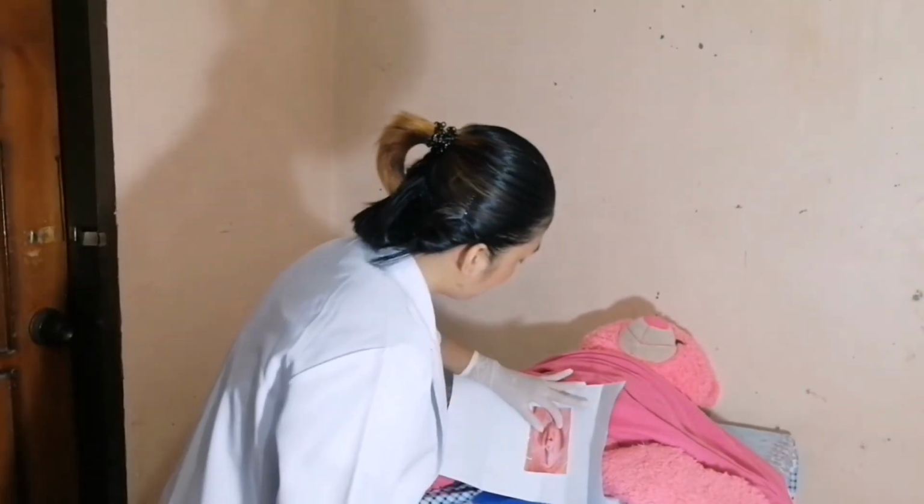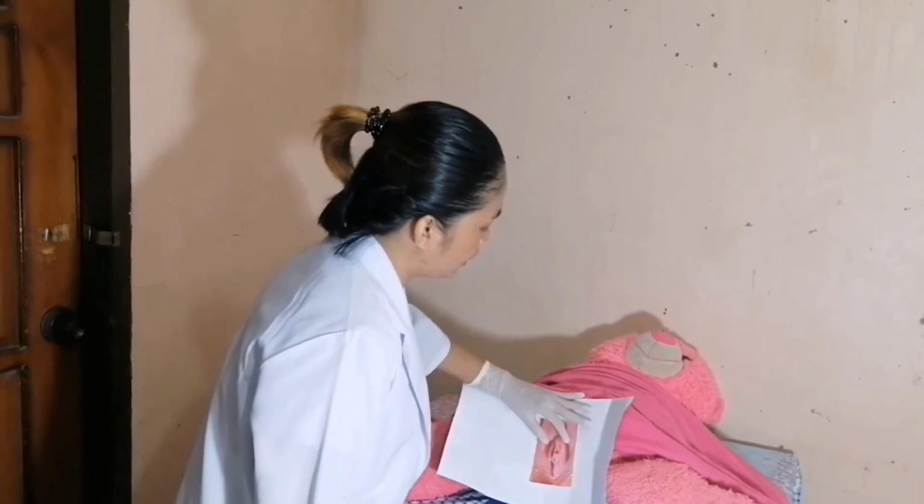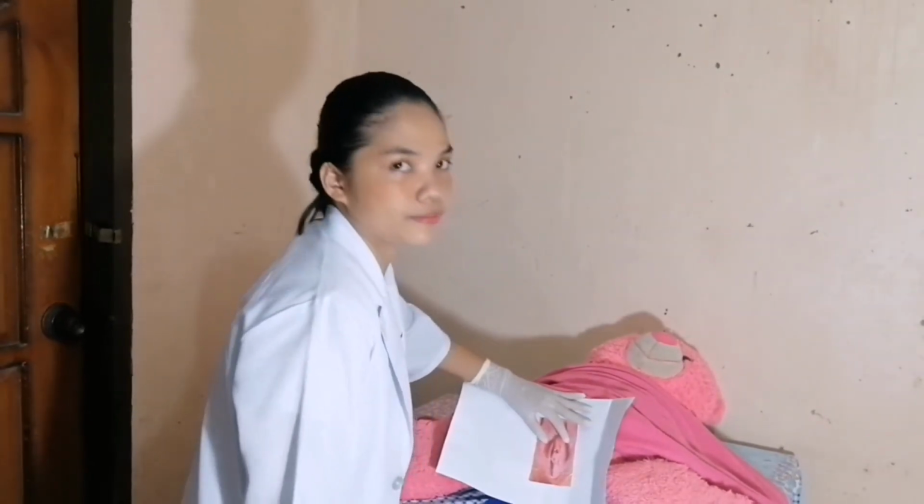With the thumb and forefinger of your non-dominant hand, spread the labia and identify the urinary meatus, and maintain the hold until the catheter has been inserted.